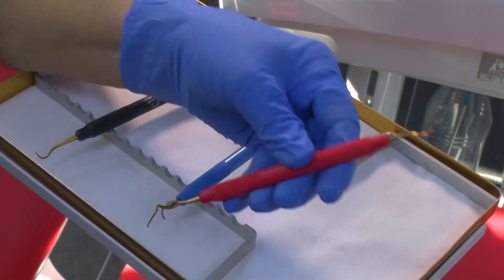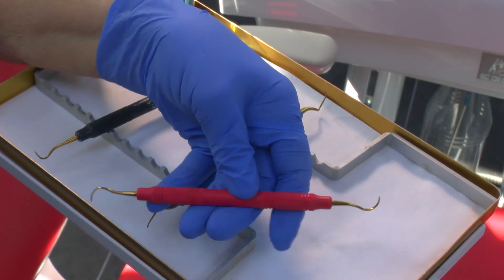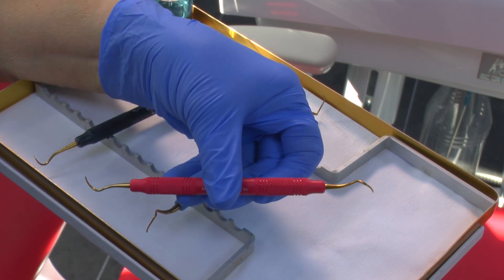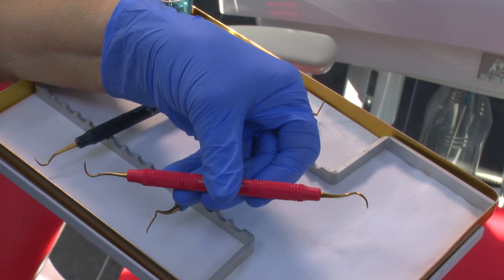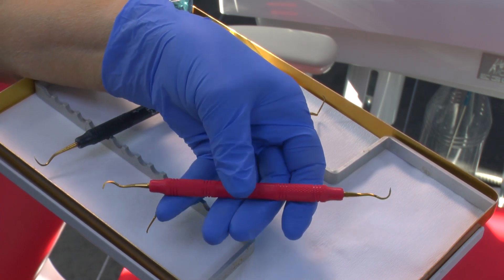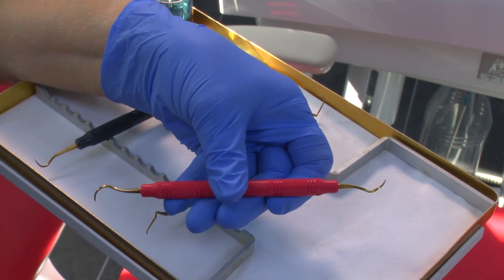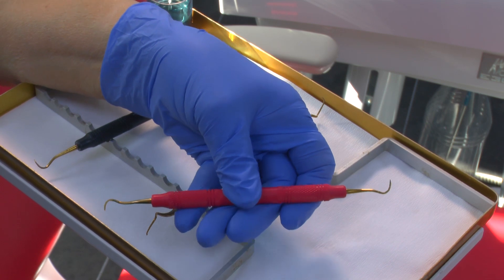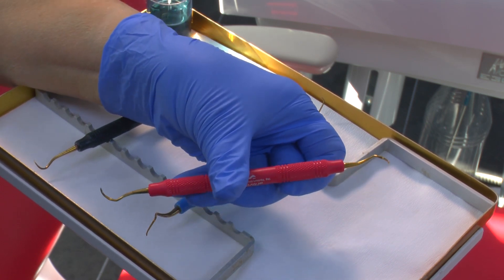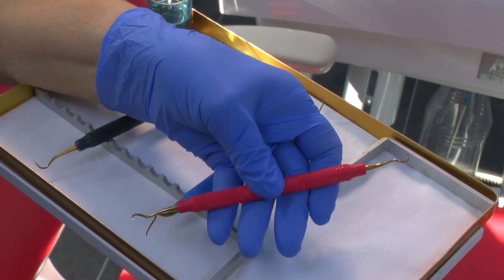The next one is absolutely brilliant for gross scaling — it's called the Claw and it's from American Eagle. The Claw is very similar to the Jacks but much larger, so it's got quite a lot of power. It's a very sharp instrument, excellent for removing tenacious calculus, but remember not to put too much pressure on it because once they've lost their edge they can break.